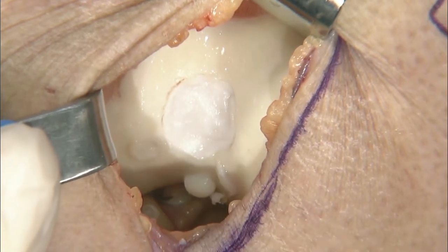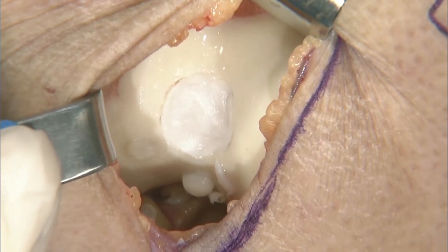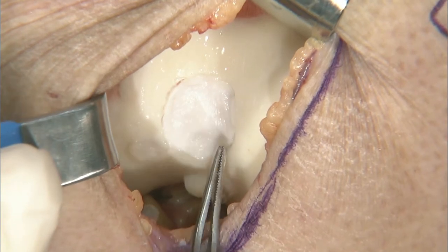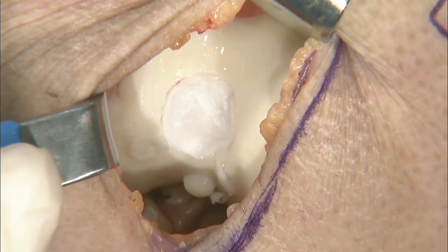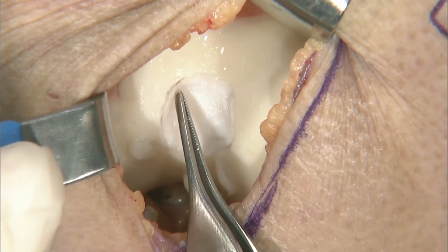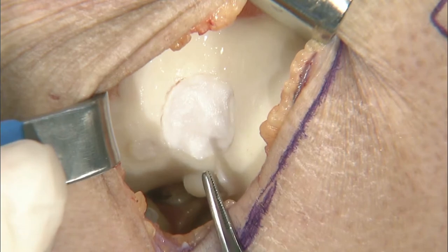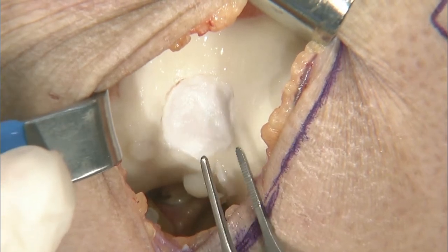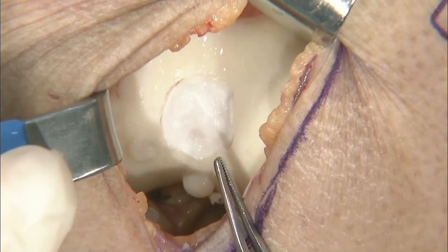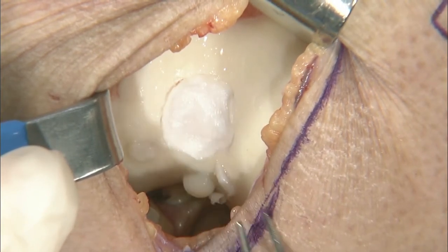And where this gets a little difficult, where it's different than ACI, is the membrane before was very easy to trim because it was sitting on the top. If you look at this defect, and it's hard to see here, but you'll see it in the lab, it's actually sitting in the base of that defect right there. So once you say, okay, it doesn't quite have the stretch that the BioGuide membrane did, it gets a little bit difficult to trim once it's in there. What you're going to find is that you're going to end up cutting kind of straight lines of it, and it's not going to look pretty.